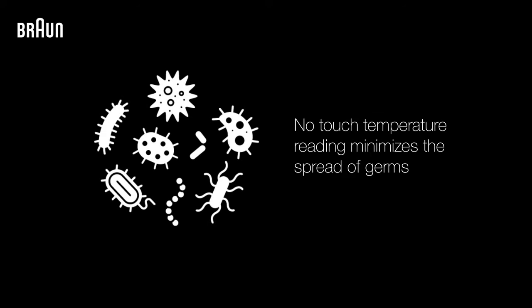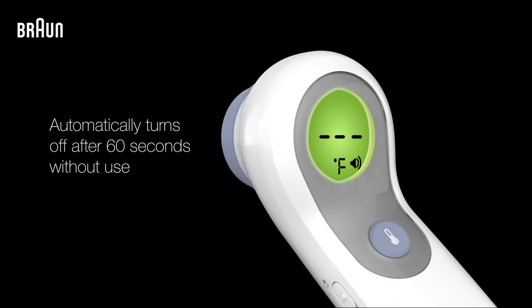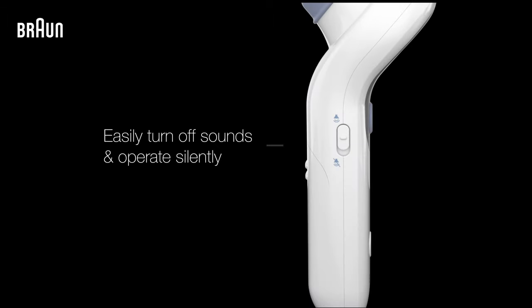Using the no-touch temperature reading feature helps to avoid skin contact, which can minimize the spread of germs. When you're finished using your thermometer, press the power button again to turn it off, or it will automatically power down after 60 seconds without use. You can turn off any beeps or sounds from the thermometer by simply sliding the sound switch into silent mode.